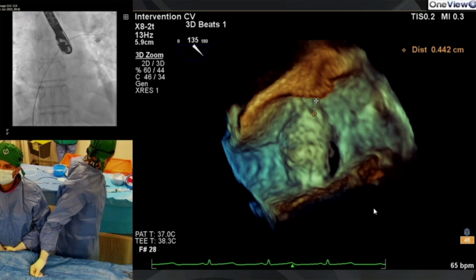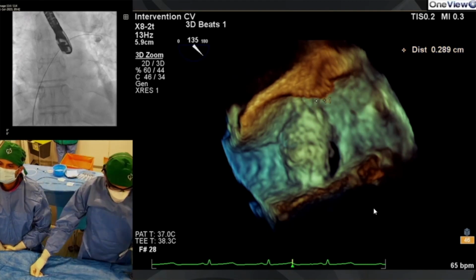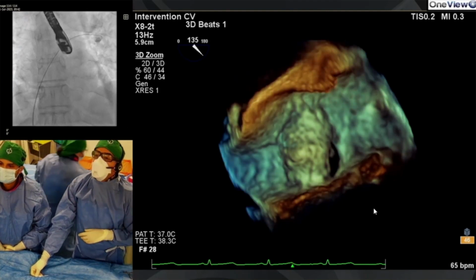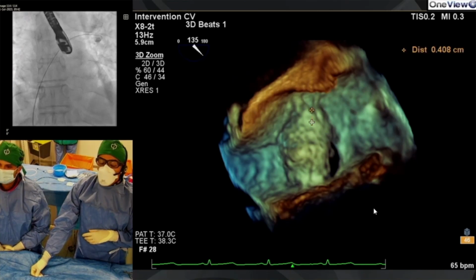And in terms of a potential tunnel, it suggests that there isn't much of a tunnel just looking at this 3D directly. I'm just going to find the right measurement. So if we assume the fossa is here at the top, then this is the length as a rough guide. But obviously, I'm just going to show you a little bit more in a second. Maybe not too much of a tunnel.